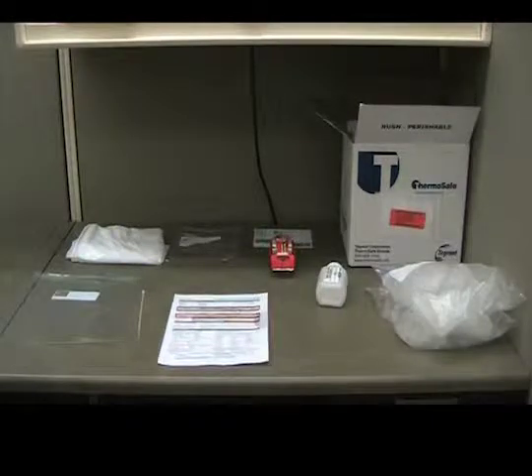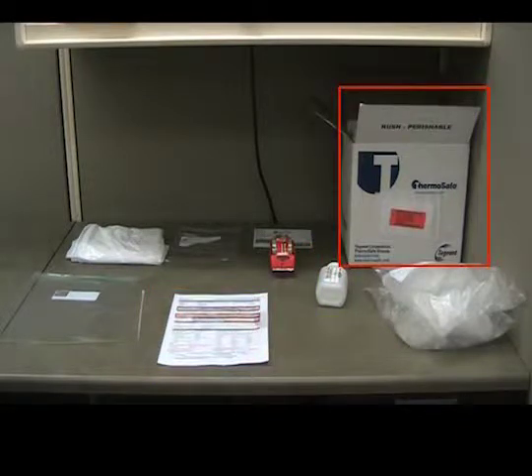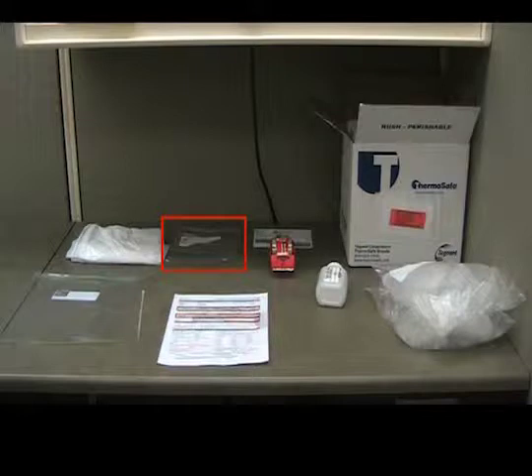To pack and ship your total phosphorus samples, you will use the following materials: a 250-milliliter polyethylene bottle containing your sample, a lab slip, shipping cooler, a quart Ziploc bag, two one-gallon Ziploc bags filled with ice cubes, one empty gallon Ziploc bag, one plastic zip tie, one large plastic liner bag, a prepaid shipping label, and shipping tape.